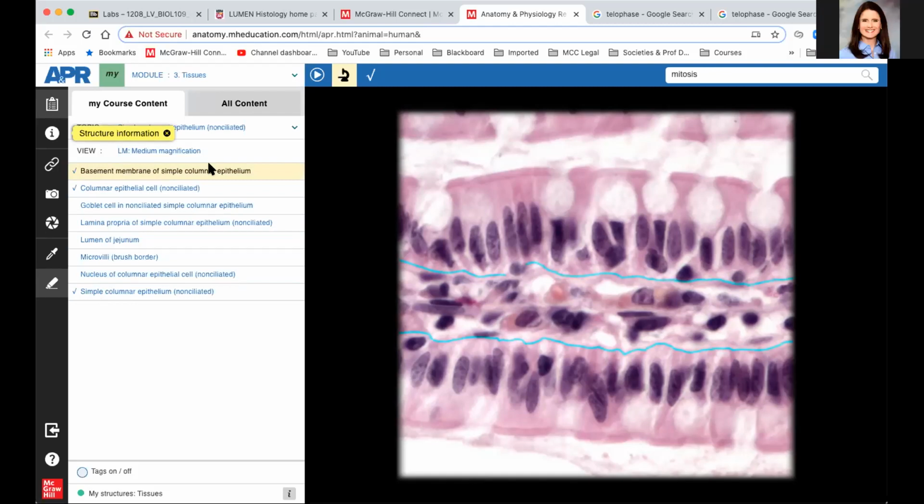There you go. This part here looks cellular in structure, but that's some other layers. It's going to contain blood vessels and all sorts of other stuff, and we'll get into that later when we get into the digestive system.